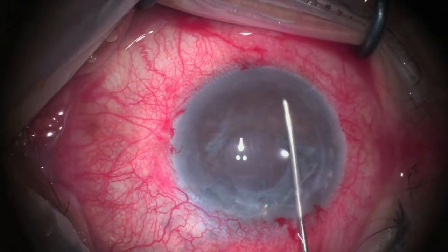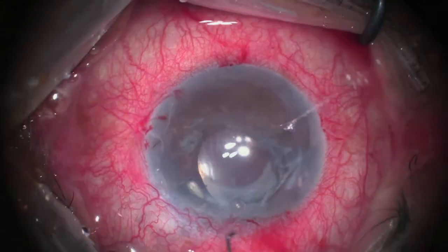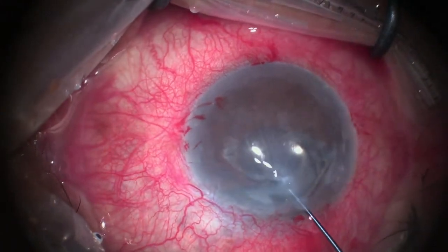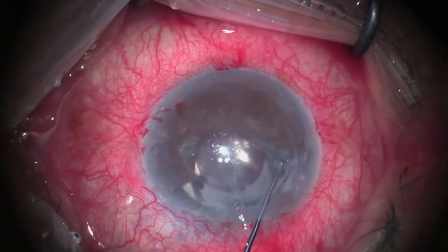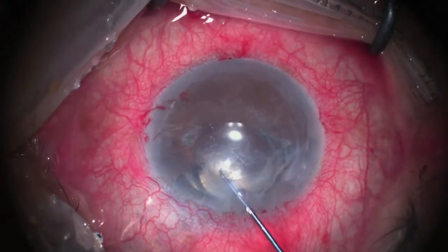This is followed by the use of a reversed Sinskey hook to complete the stripping of the diseased Descemet membrane. Note that stripping of Descemet membrane in eyes with bullous keratopathy is more difficult than in those with Fuchs endothelial corneal dystrophy.